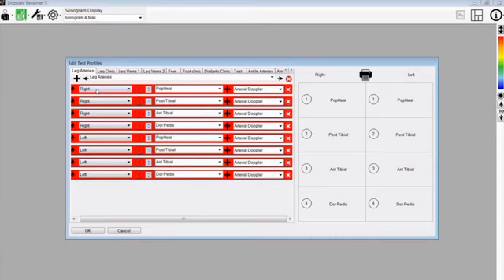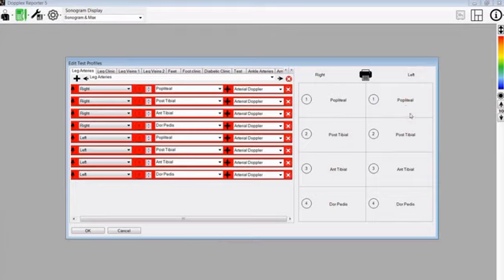The order in which you have these shown is the order in which you do the test. On the right hand side is the order in which these vessels will be printed out. As you can see, popliteal will be at the top and dorsalis pedis at the bottom of the page. Once you are happy with this profile, which we have selected as leg arteries, you can press OK and these changes will be saved.